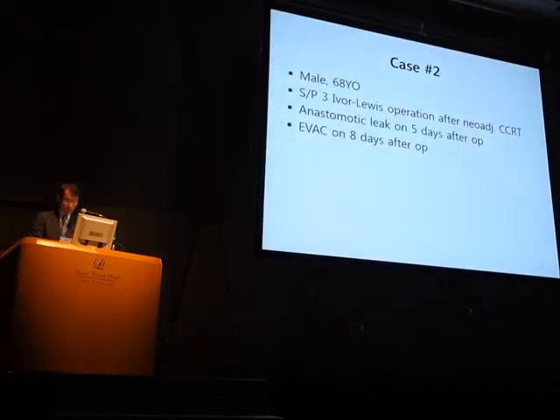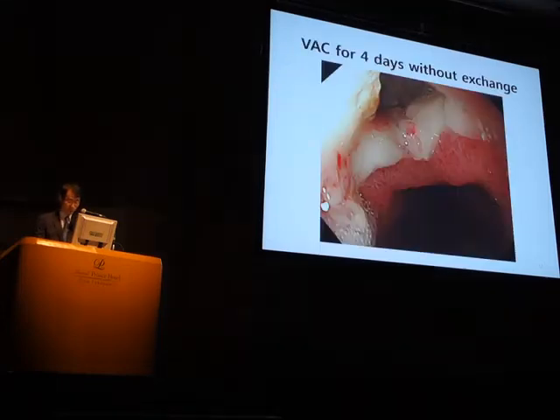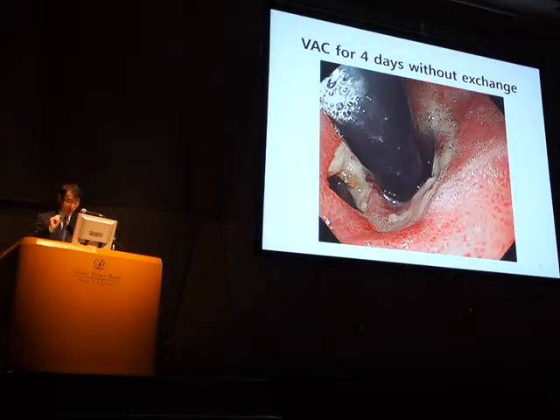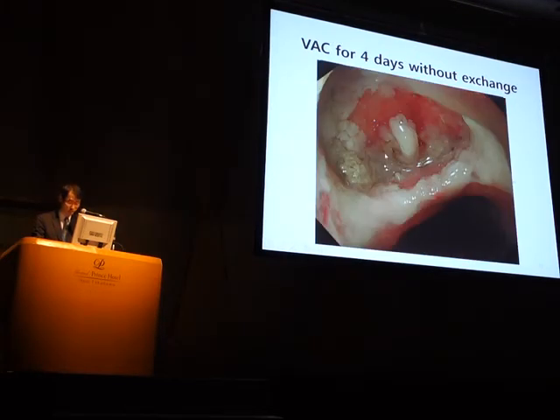Another case, 5 days after Ivor Lewis operation, anastomotic leak was detected endoscopically, and 3 days later, endoscopic vacuum treatment was applied. Just below the anastomosis, about 1 centimeter size small wound cavity was noticed. Because the size of the cavity opening was small, only 4 days after treatment, the wound cavity significantly reduced with granulation tissue growth. Therefore, no more vacuum therapy was necessary in this case.